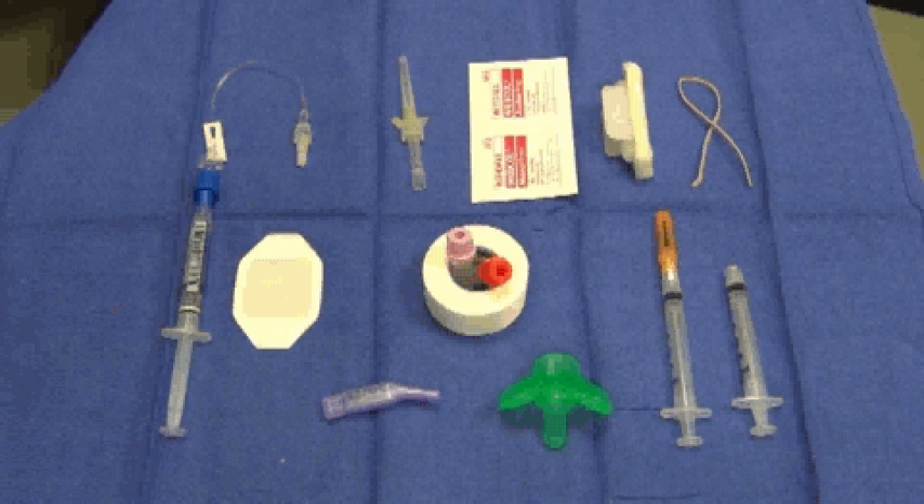The supplies required for this venous puncture technique include alcohol swabs for cleansing and chlorhexidine for sterilization of the skin. A 24-gauge angiocatheter to access the vessel. A 3ml syringe with a blunt tip for aspiration of the free-flowing blood. The appropriate microtainers for storage of the specimen. An additional 3ml syringe and a tourniquet if so desired.